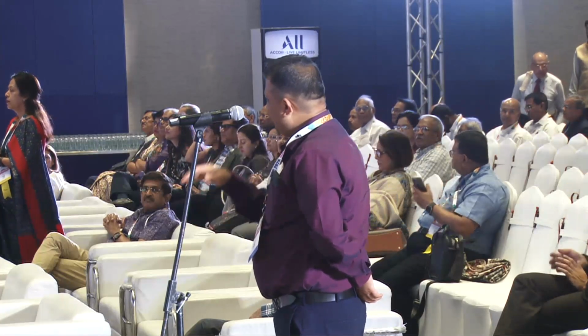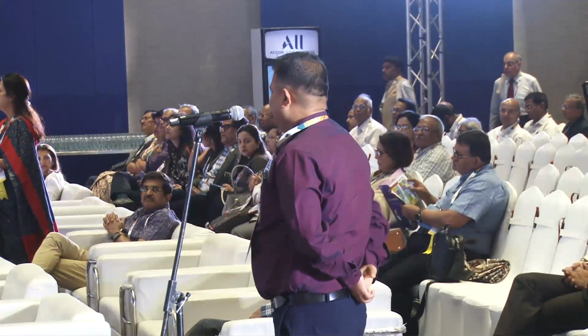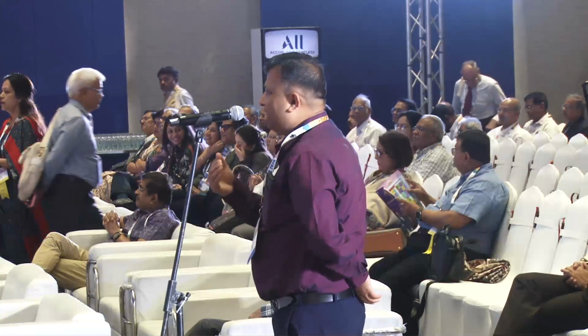Sir, one problem that I face sometimes: the rent occurred, I did vitrectomy, I placed the three-piece lens, I did the optic capture. And next morning when I do the post-op evaluation, I find vitreous in the AC. How do I avoid this situation?